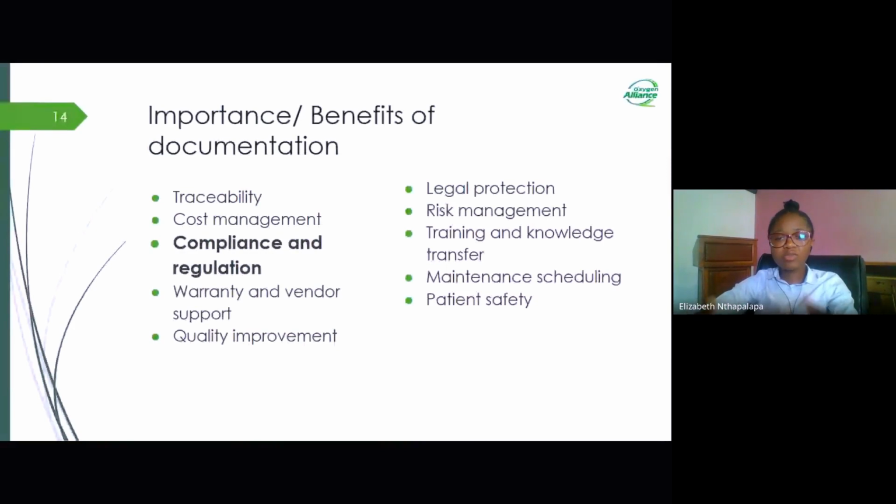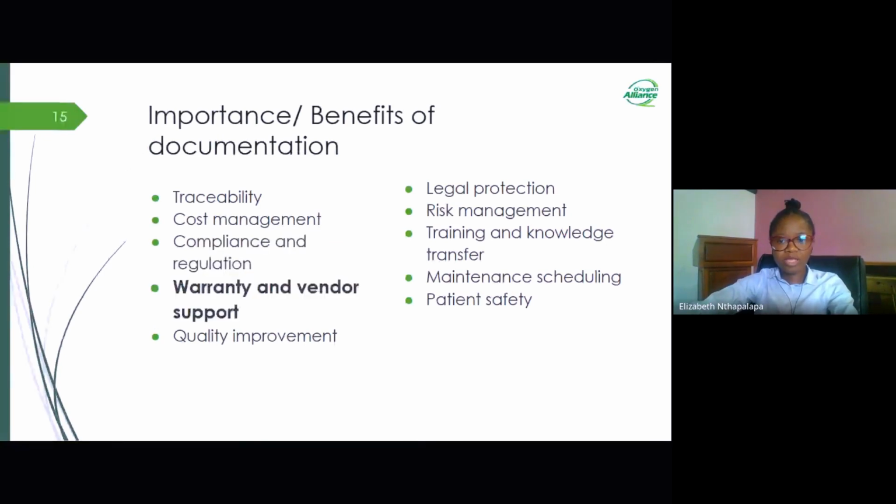So with the act of having all those proper documentation, it helps that the equipment maintenance and handling should meet the required regulations. So it reduces the kind of risk that can come along when we are violating those regulations. Every time we keep records, we are safe that we cannot end up in any situation whereby we are violating any compliance regulations.